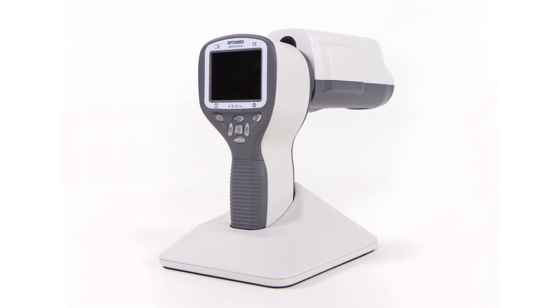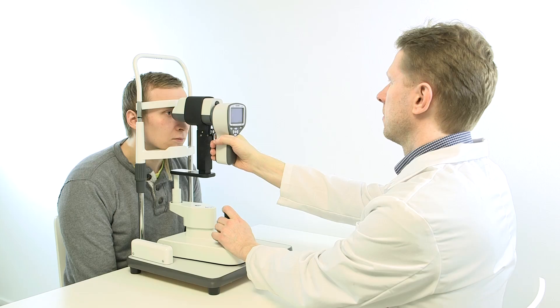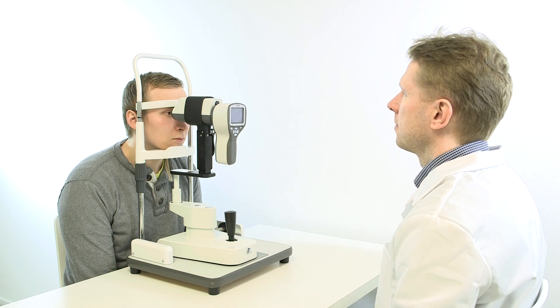SmartScope FA is an advanced and modular device that delivers high contrast and quality fluorescein angiograms. Let's go through the steps for achieving optimal image quality during a fluorescein angiography examination with SmartScope FA.